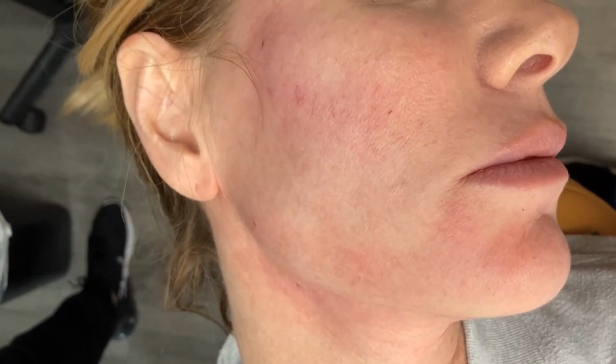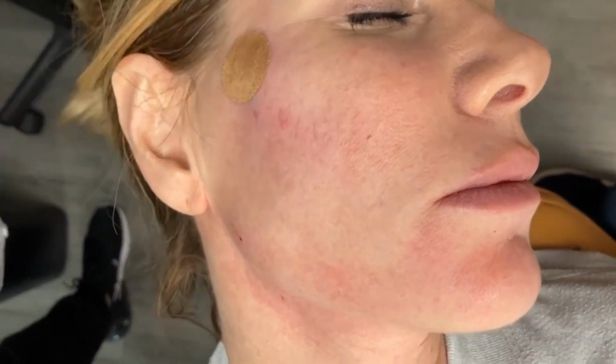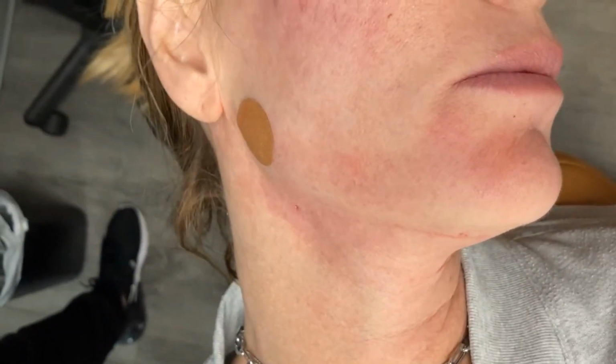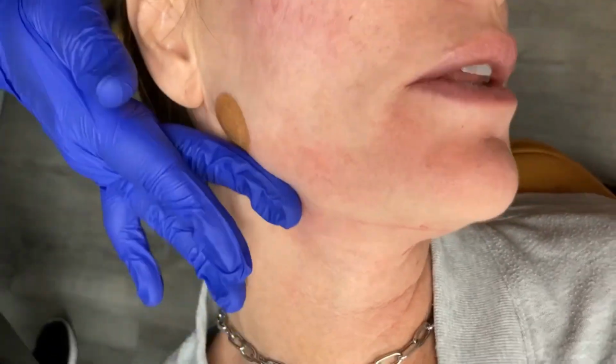But take a look at the result. Look how tight that jawline is. Look at that snatched jawline. Look at that lift with the cheek popping out, and that is looking absolutely fantastic. Make sure the area is clean and put band-aids on, and now the patient is ready to go and heal up here. Here is an amazing before and after on this patient, as you can go ahead and see.